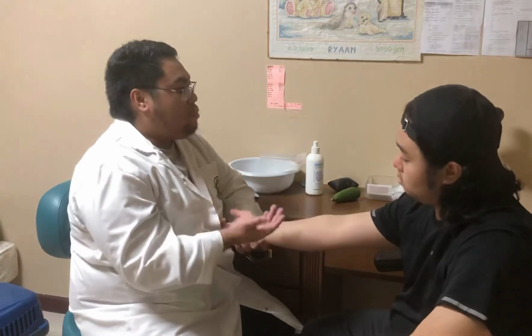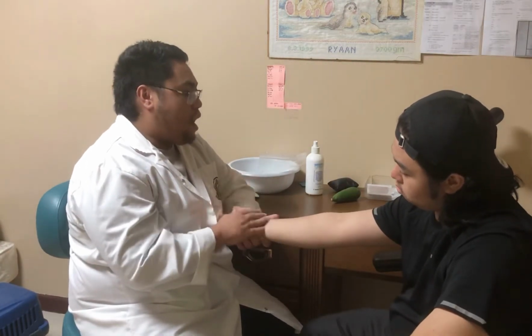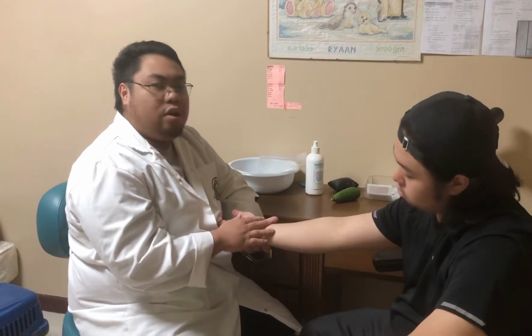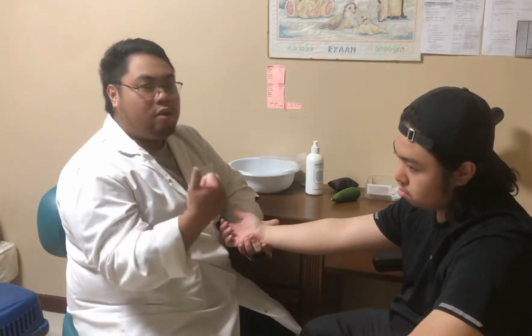So basically, this is always the first choice, except for cases where the patient has a history of circulatory impairment of the extremity or cardiac arrest, or it has been punctured so many times. So sir, do you have any contraindication? Okay, so it is successful.